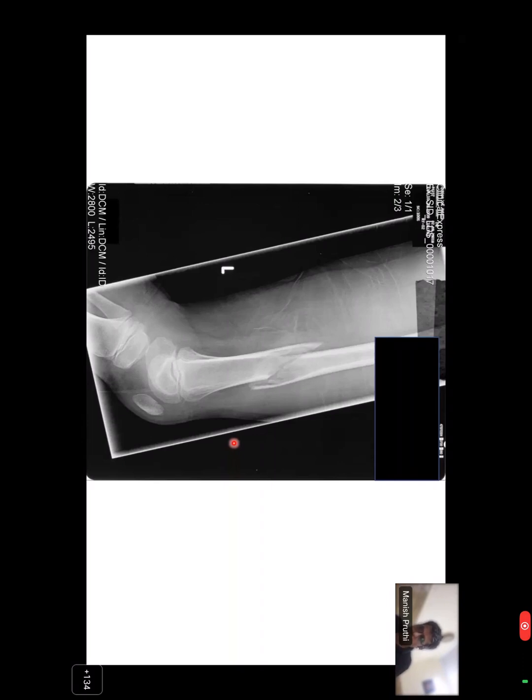So these come in borderline when you have a wide zone but no significant periosteal reaction. Then you are thinking of some locally aggressive pathology, but you are not sure whether you are dealing with a benign versus a malignant situation. In these cases, further imaging can obviously help you, like an MRI or a CT scan. But yes, it becomes a challenge when you see a wide zone of transition but no periosteal reactions.